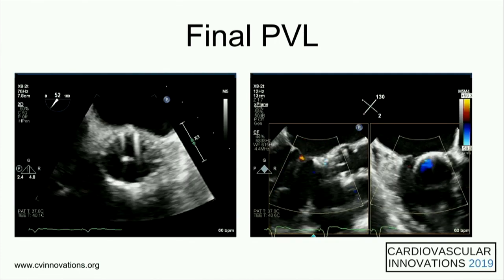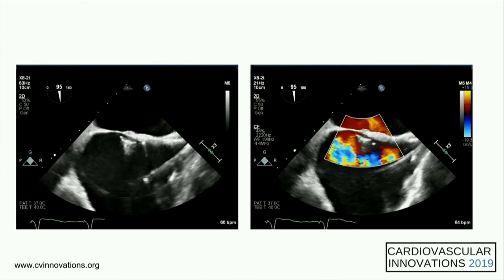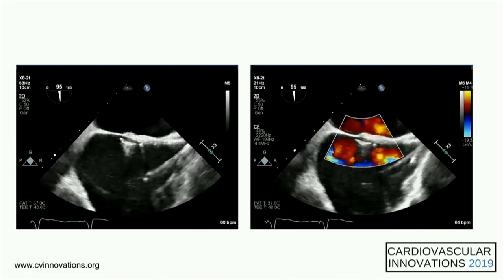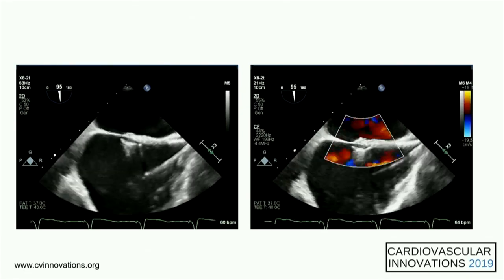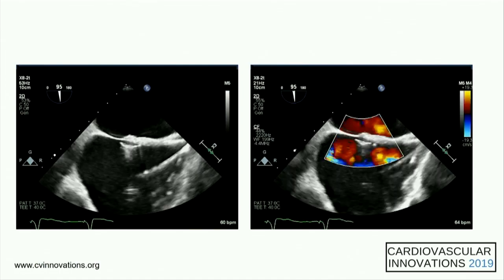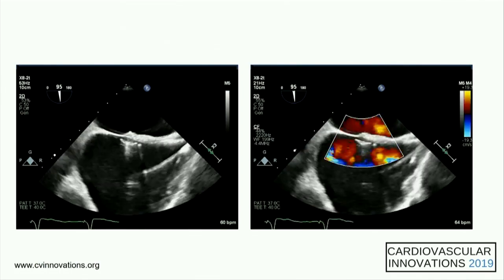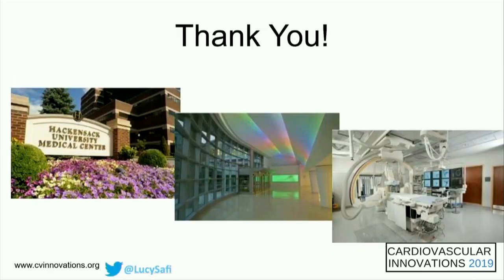Because we created an iatrogenic ASD in someone with an LVAD, we had to close that. So we went ahead and closed that on our way out. And ultimately, he did very, very well. He's about a year out now from this procedure with absolutely no alarms, and he's doing great, and kidney failure is resolved. Great. So thank you. Wow.